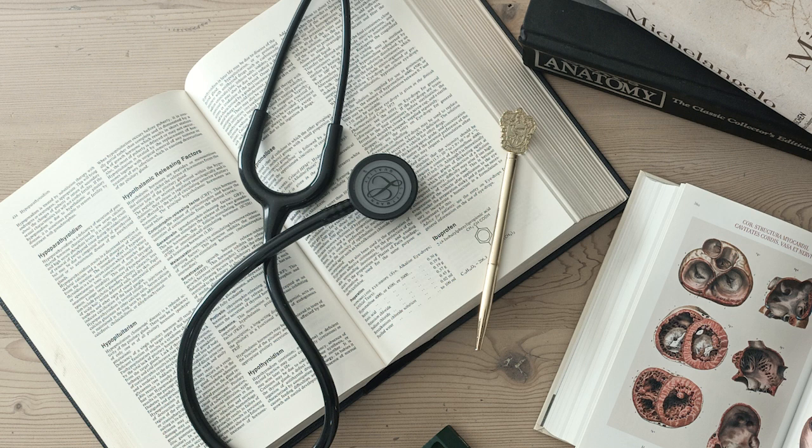Okay, and how about right bundle branch block, RBBB? What are its ECG hallmarks? For right bundle branch block, the right bundle branch is blocked. Early ventricular depolarization occurs via the left bundle branch first, and then the right ventricle depolarizes slowly, again primarily through cell-to-cell conduction.